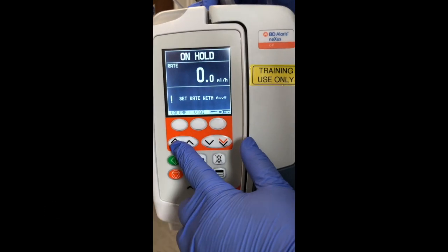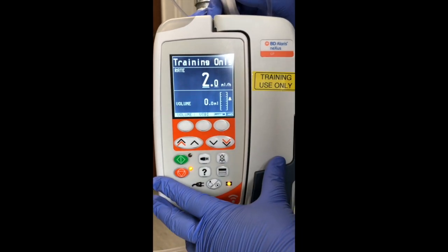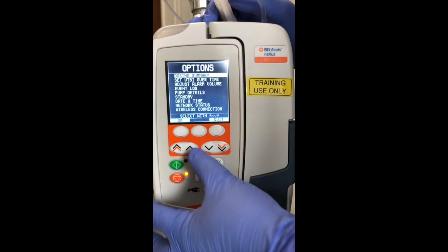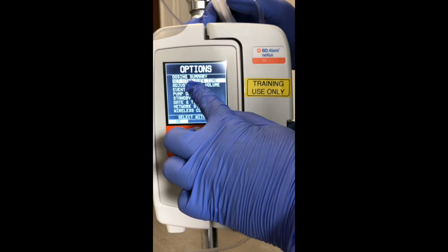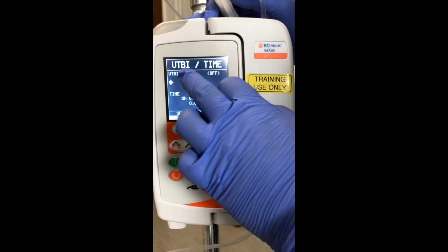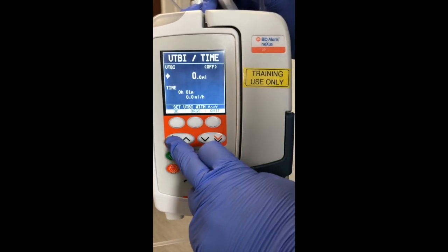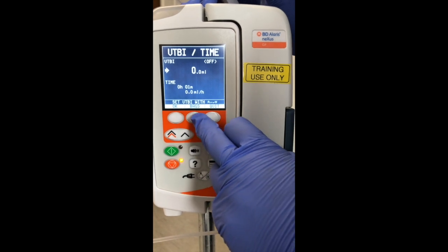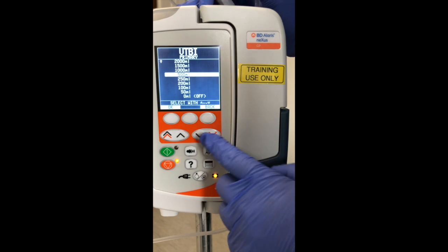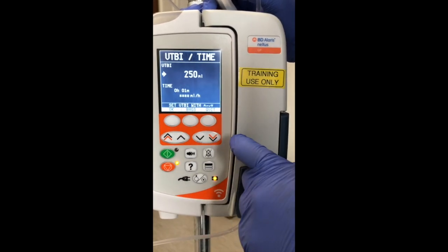You can use this double chevron or the single chevron to set a rate, or the other method of doing that is by pressing the question mark, and you'll find second from the top is set volume to be infused over time. So I'm going to choose that, say okay, and volume to be infused, the little arrow is pointing to that. Again, I can use my chevron keys to get to the desired amount, or I can press bags, and that's got the preloaded amounts already on there. I'm going to choose 250, okay.